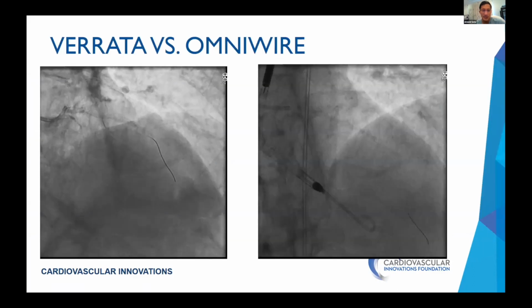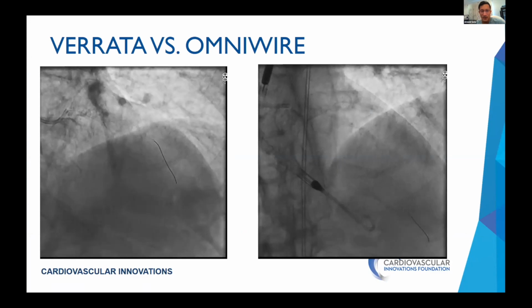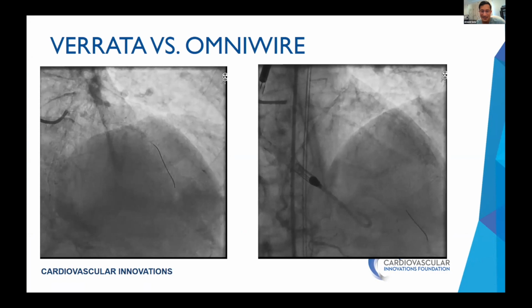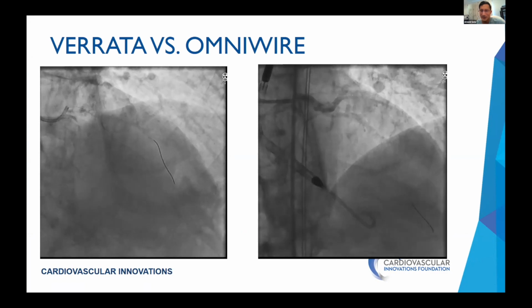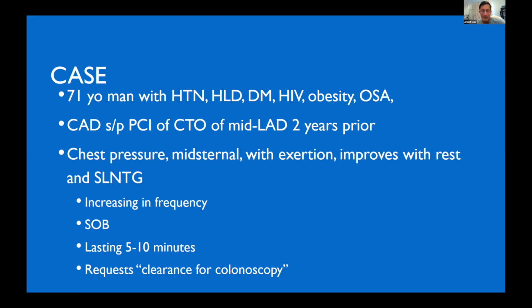Another example here, this mid-LAD calcified lesion, I'm pushing and pushing with the Verrata wire. I can't get it past the lesion. The sensor just seems to get stuck on the calcium, but the Omni wire is able to cross easily. That's just an example of what you can do now with new technologies.